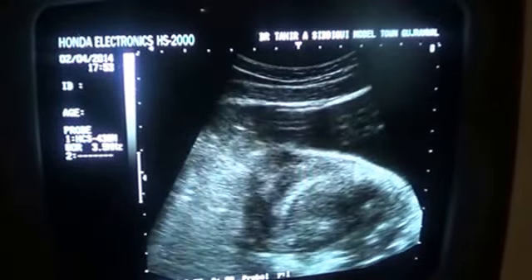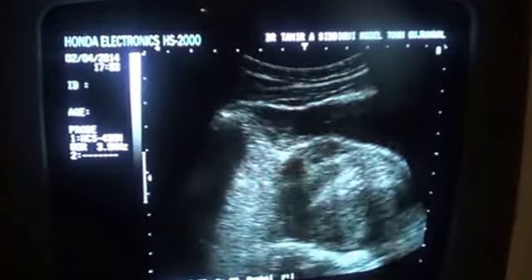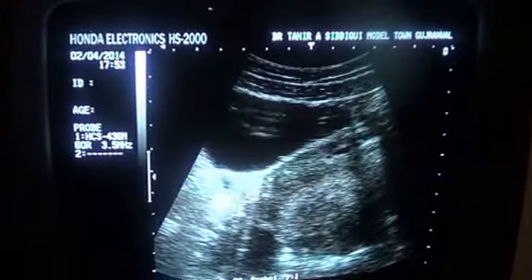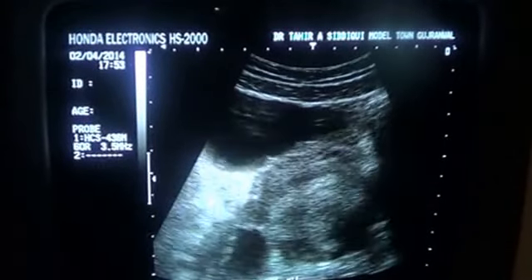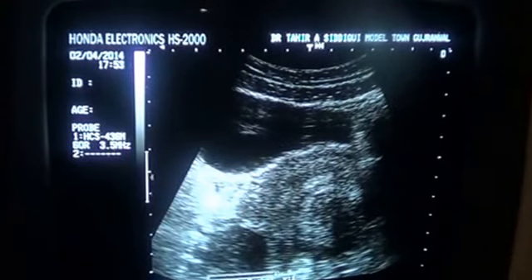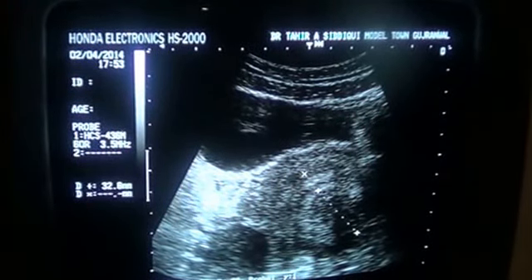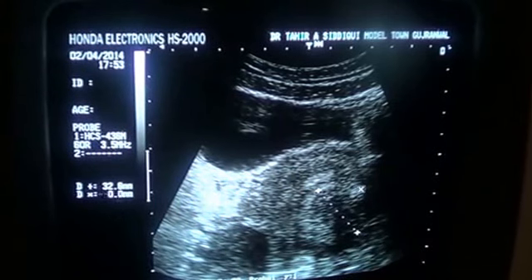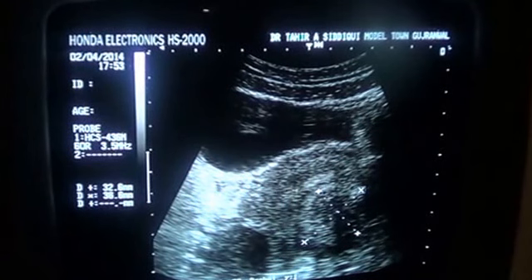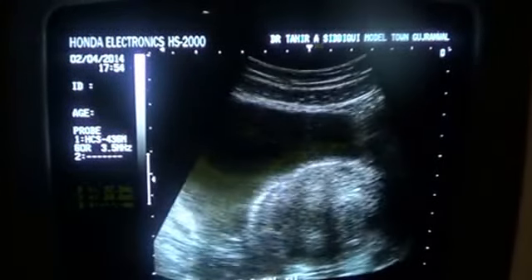This is from one view the pathology we are getting. So let's move ahead. Now this is the transverse section, and in the transverse section you can see that this is a fibroid, well demarcated, this one. This is a fibroid, intramural, relating to the posterior wall of the uterus. This is the endometrial canal, and this is the anterior myometrium in this view.